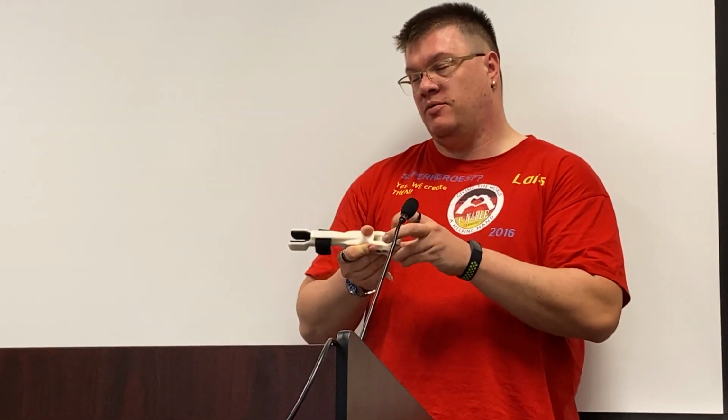I come with the idea of making a movable feet, and the problem was when he steps on his prey with 25 kilograms, the bird weighs like 4 to 5 kilograms, so he steps on a prey like 25 kilograms. I cannot print this part in one piece because they wanted to have a look roughly like the feet of the bird.